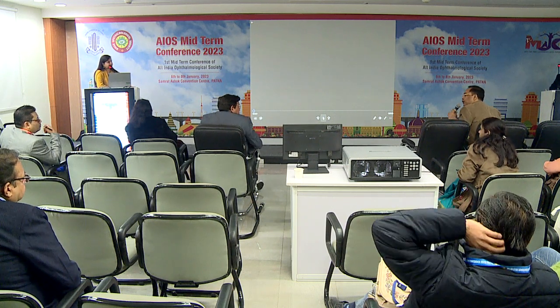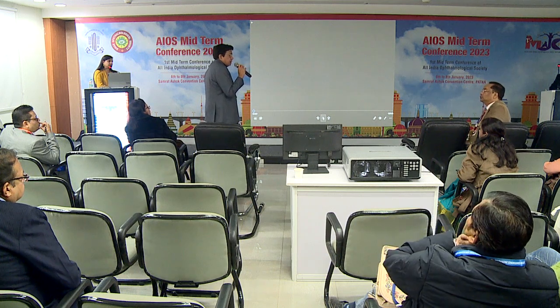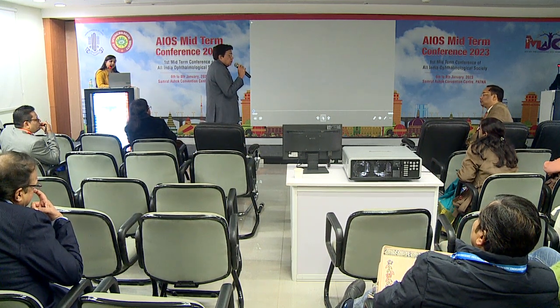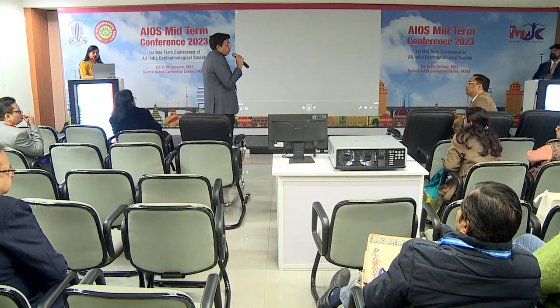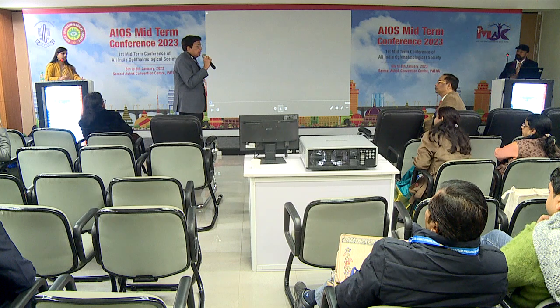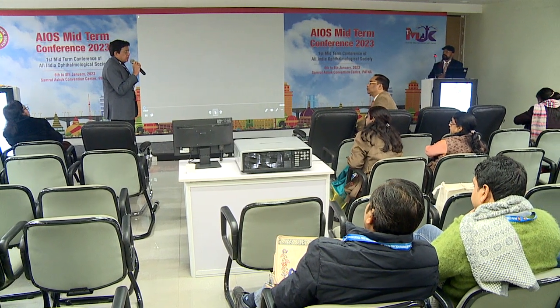What are your views on EDOF lenses for pediatric cataracts? We have used EDOF, even trifocals in pediatric cataract. With pediatric, if you're talking about less than 6 years, no. But beyond 6 years, when most of the maturation of the apparatus and the growth of the eye has happened, we've used trifocal lenses also. And there have been instances, and even the earlier array lenses, a few of them we have used. And when the patients cross the age of 18, we have done a laser touch-up for these cases.